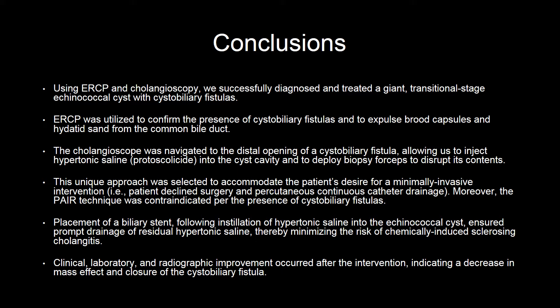Using ERCP and cholangioscopy, we successfully diagnosed and treated a giant transitional stage echinococcal cyst with cystobiliary fistulas. ERCP was utilized to confirm the presence of cystobiliary fistulas and to expulse brood capsules and hydatid sand from the common bile duct. The cholangioscope was navigated to the distal opening of a cystobiliary fistula, allowing injection of hypertonic saline into the cyst cavity and deployment of biopsy forceps to disrupt its contents. This unique approach was selected to accommodate the patient's desire for a minimally invasive intervention; moreover, the PAIR technique was contraindicated per the presence of cystobiliary fistulas. Placement of a biliary stent following instillation of hypertonic saline ensured prompt drainage of residual hypertonic saline, thereby minimizing the risk of chemically induced sclerosing cholangitis. Clinical, laboratory, and radiographic improvement occurred after the intervention, indicating a decrease in mass effect and closure of the cystobiliary fistula.